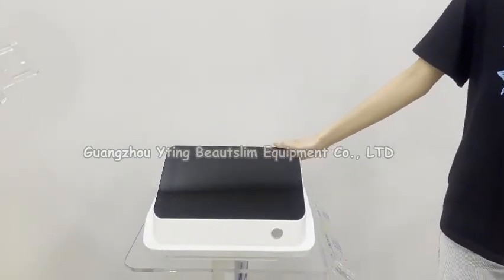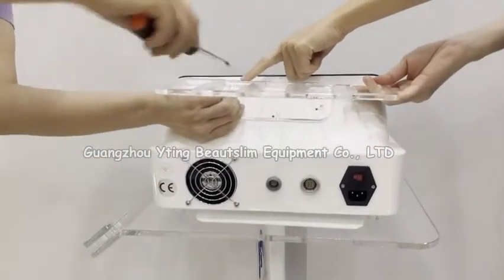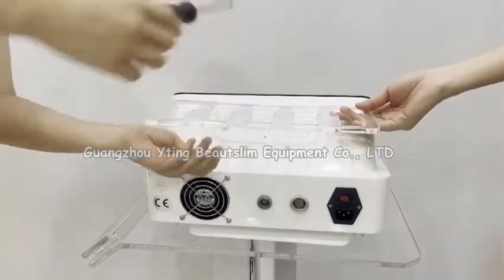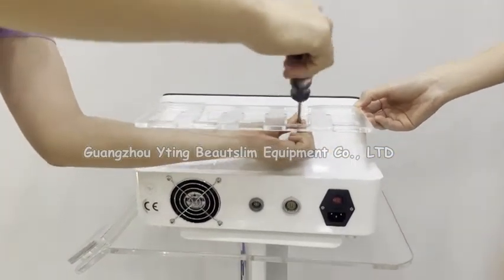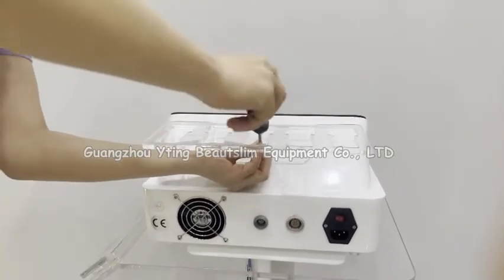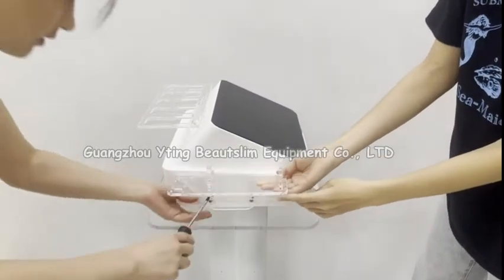Now we install the two-in-one machine. Firstly, we connect this handle holder and put the screw here. You can now rotate the screws here.